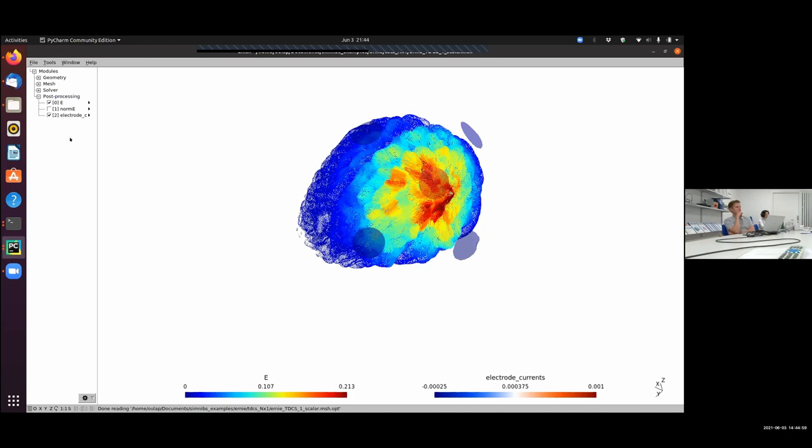This is then part of neural modeling, which was already pointed out by Andreas Fallgatter today, that this can be done but needs additional software, for example, Neuron, or the toolbox from Alexander Opitz, which can do that. But I would say this is still much more on an early research level, because it's really a difficult question how rTMS pulses interact to create some neuromodulatory effect, but it's very exciting.